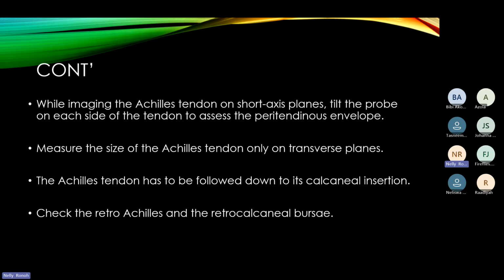Also, remember, even when there are no tears in the tendon, there could be inflammation, like tendinitis. When there is inflammation, of course, there will be fluid collecting around, and the patient could actually present with pain. And then you measure the size of the Achilles tendon only on the transverse plane. And the Achilles tendon has to be followed down to its calcaneus insertion.